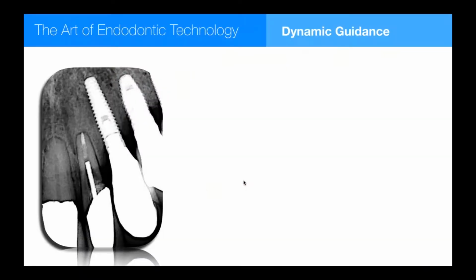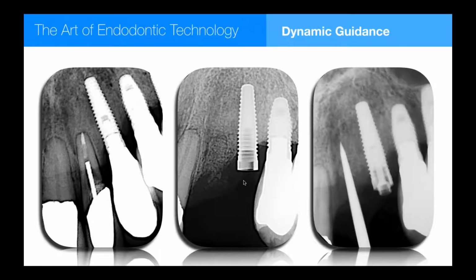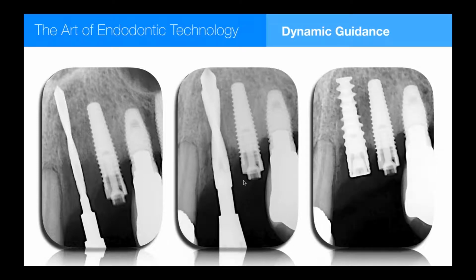This is an implant case, previously placed implant in the cuspid position. This lateral is failing for structural reasons. I extract it, graft it with a PTFE membrane, and come back, and I'm able to snake a 3.5 by 15 millimeter Nobel Active in here, just exactly between the implant and the adjacent natural tooth. And that just got restored and looks remarkable. We used to say you could never put implants that close together, but we can now.